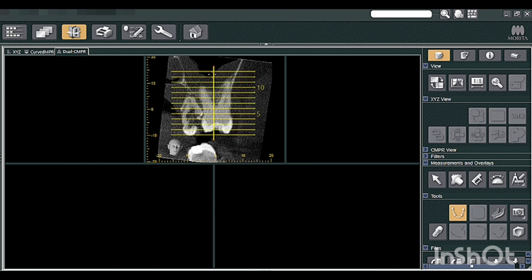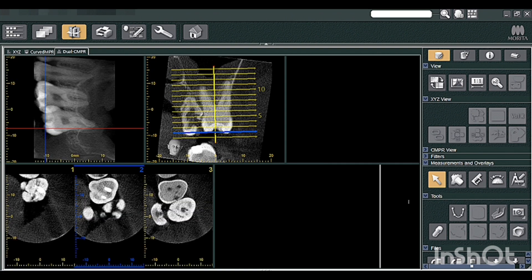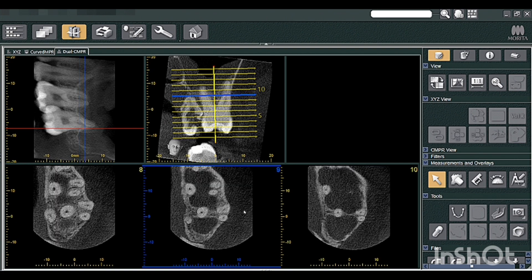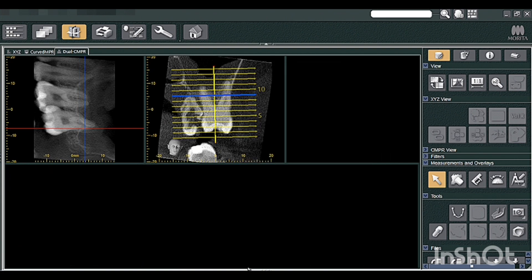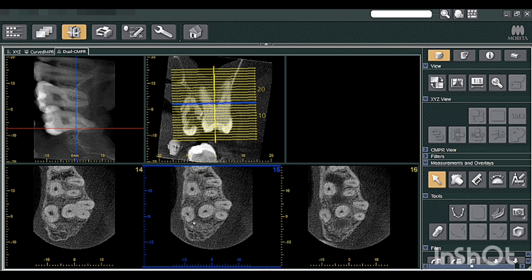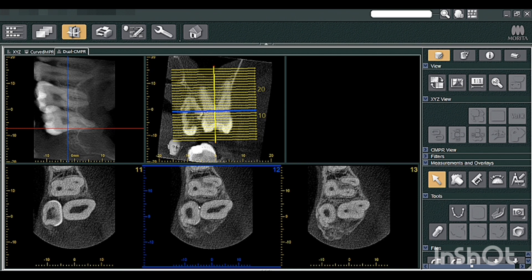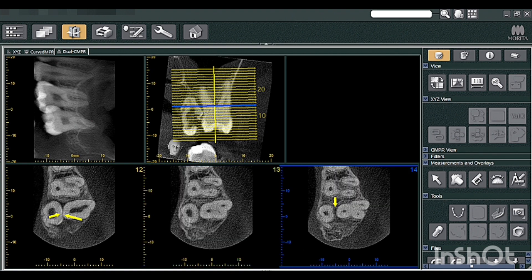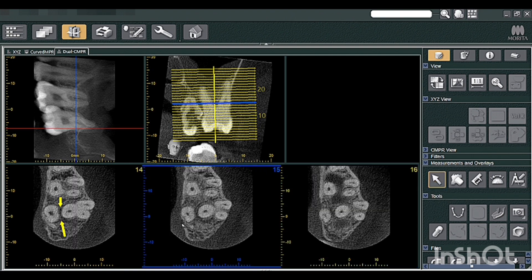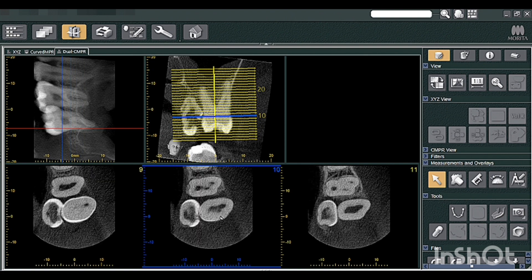You can study the same in the axial cross section to see how tooth 28 is palatally placed. Study it in 1 mm interval lines and see how it is palatally placed. Setting different cross sections is important because it becomes easy to understand whether the tooth is fused or not. In this case we can easily make out that the teeth are not fused — they are separate from each other. You can mark these lines and see the line of separation. Tooth 28 is palatally placed and 27 is buccally placed — normal position.